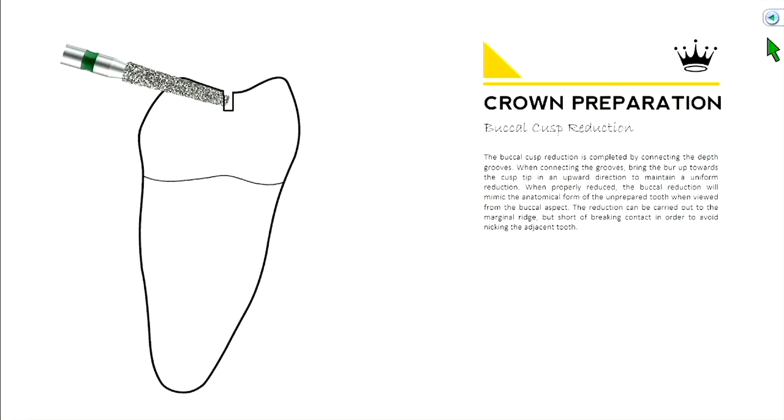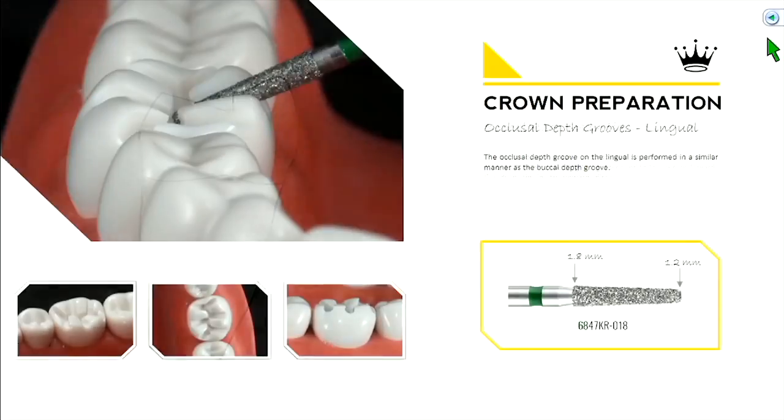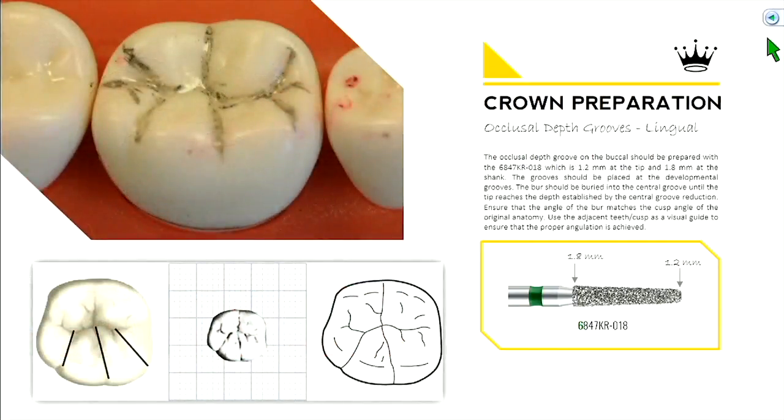Notice the angulation of the burr — we're going to keep harping on this point. Then repeat the same thing on the lingual surface. Find those grooves: generally in between the two cusps and also on the sides — a little toward the mesial and distal, you'll find a small developmental groove just off to the side of the cusp heights or inclinations.